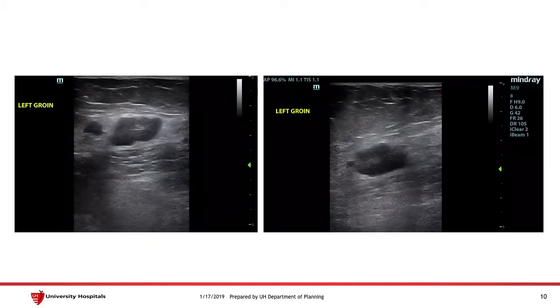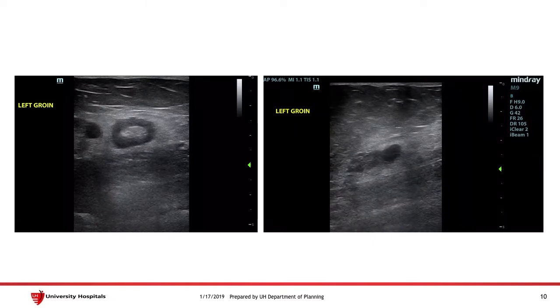Let's go over the images from the case presentation again. On the image to the left was the original video shown. As I fan through, you can see that the object actually ends, indicating that it's not a tubular structure and has defined borders suggestive of a lymph node. The image on the right is a sagittal view of the same object, and you can see again that it has defined borders and is not a tubular structure.